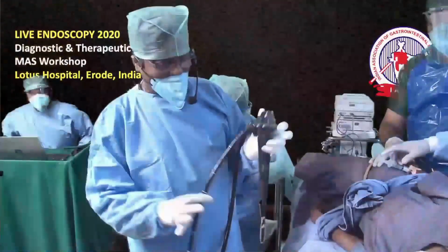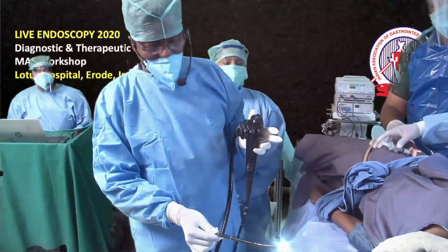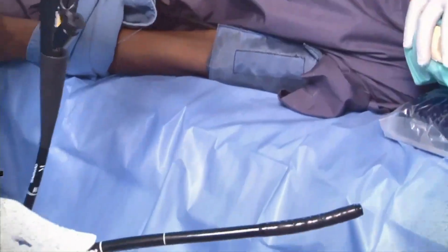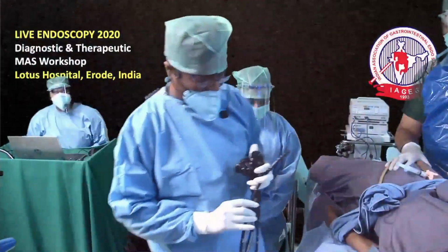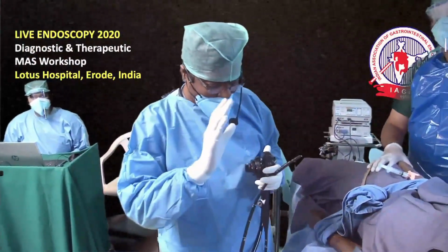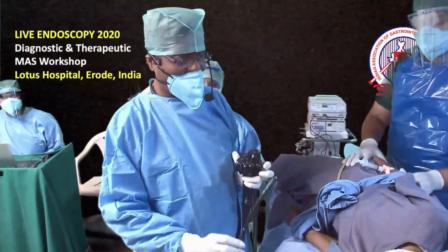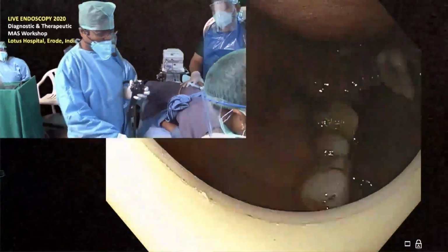The second important thing is soft clockwise rotation. And sometimes when we go into the duodenum, we'll tell later, a little bit of body movement. So wheel, shaft and body is going to tell me where I am navigating. So let us quickly have an idea overall, then we'll put it in small pieces for you to understand better. So the patient is anesthetized. I am putting it inside.